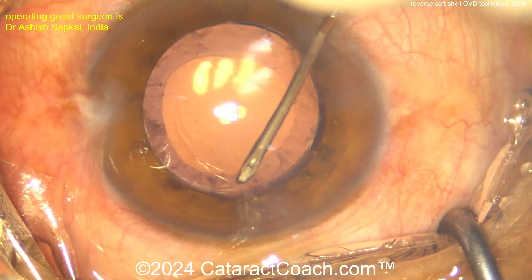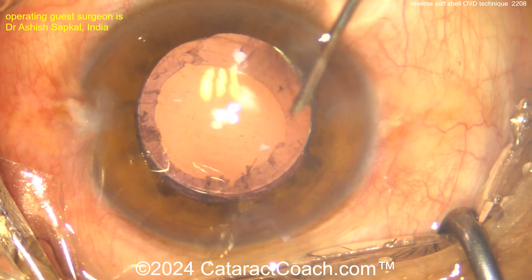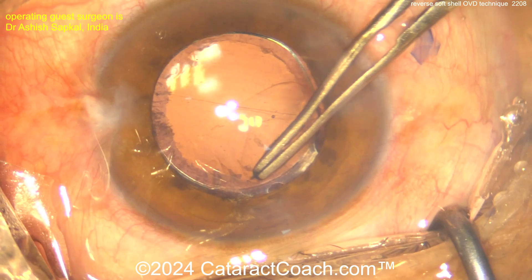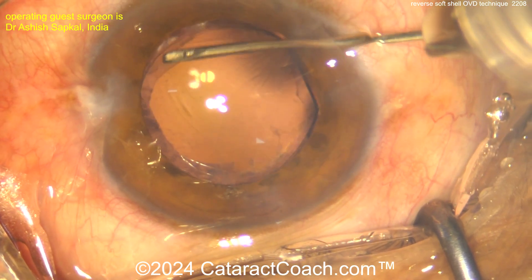The cystotome is going in to enlarge the rhexis a little bit — a small tear of the capsule here and here — enlarging it to maybe a five to five-and-a-half millimeter capsule opening. That looks pretty good. Beautiful technique.